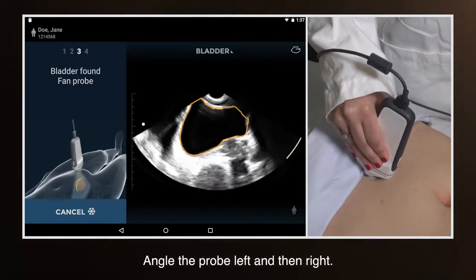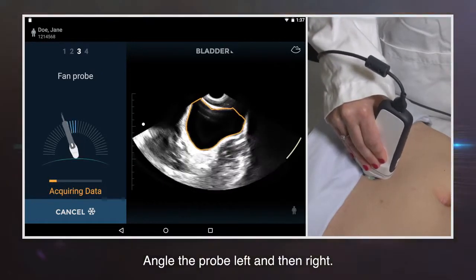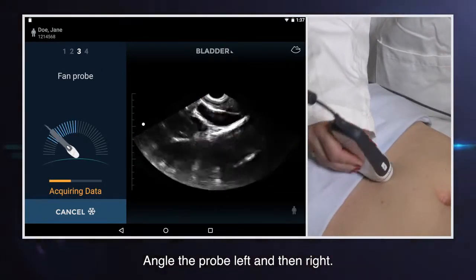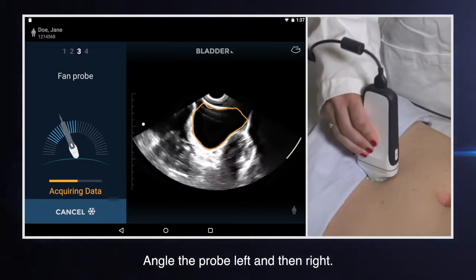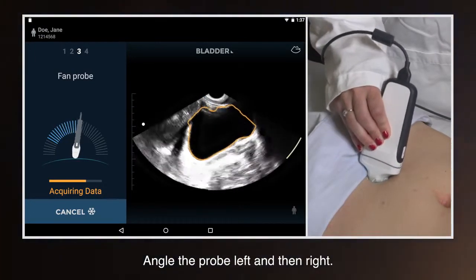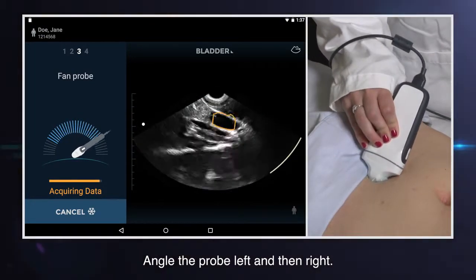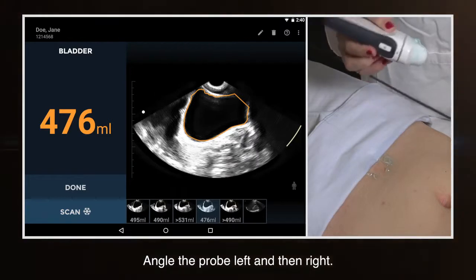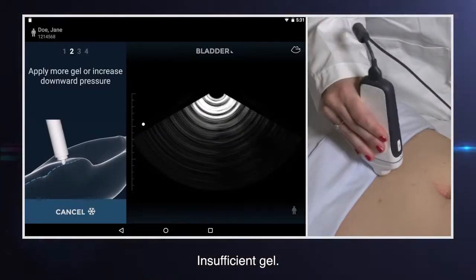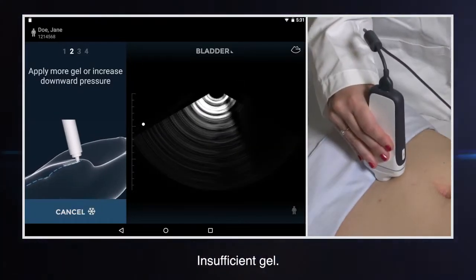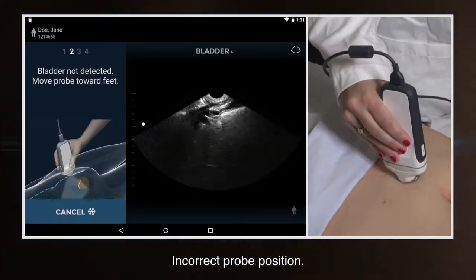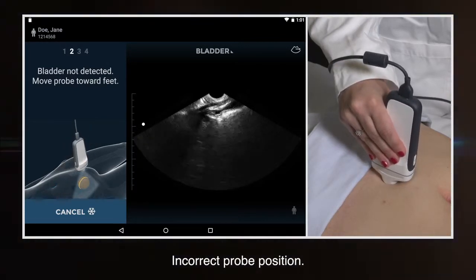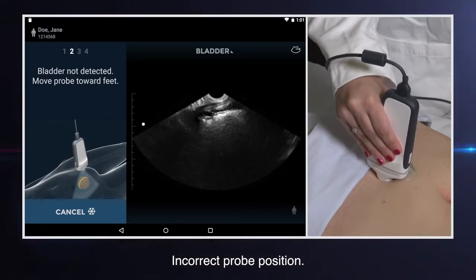Maintaining the probe tip in position, carefully angle the probe left and then right through all parts of the bladder being measured, but at least to 45 degrees in each direction. If the probe has insufficient gel or is incorrectly placed, the system will provide visual feedback.